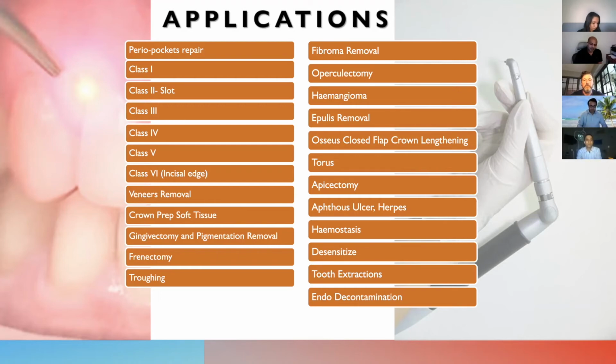Now either the veneer is a bit stained, or you need to remove it and you don't know how to remove it, so every time you have to cut it. And the amount of destruction you sometimes do cutting a veneer, because you don't exactly know where the veneer ends and where the tooth starts, is a big problem. Another scenario I always get worried about is you're placing six veneers in a patient, and one veneer was off, and you want to take it off and then put it back again. Is there a way? There is no way.